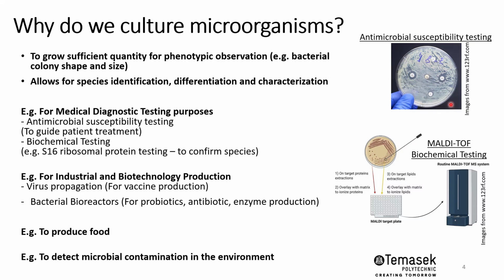So in the laboratory sessions, I think it's the last session, you will have an opportunity to work on this in a dry lab setting. So ultimately, by doing this testing, we are able to help the physician to guide patient treatment, especially for a patient who is diagnosed with sepsis, a bacterial infection.